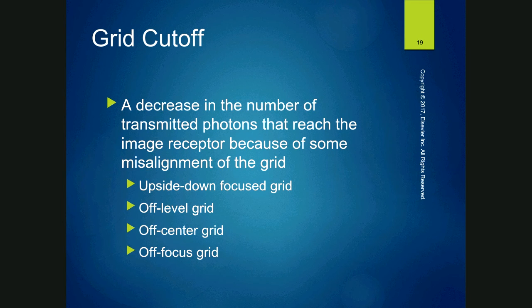Off level grid cutoff. This one is going to be the most common cause of grid cutoff. Off-level grids are common. It happens.